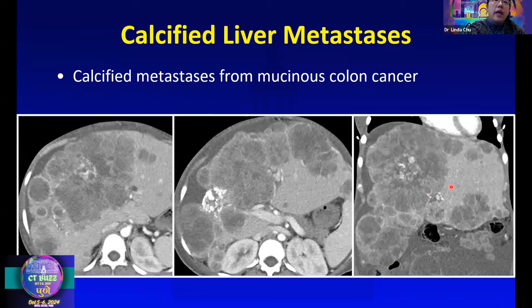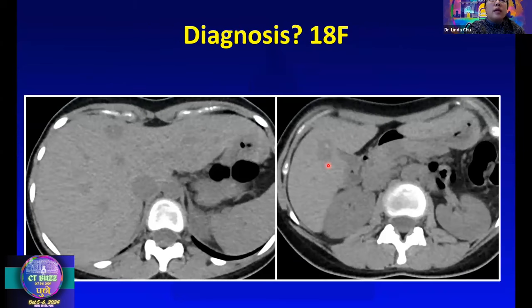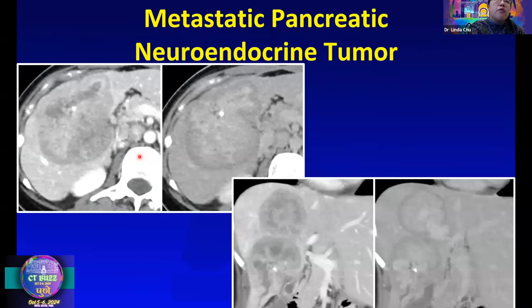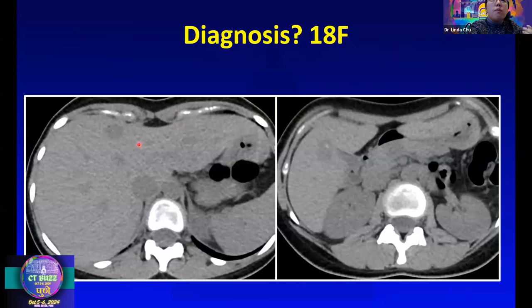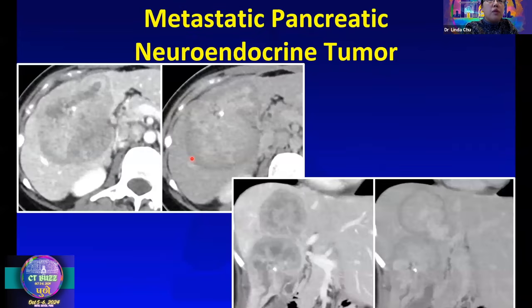Metastases can calcify — this case of mucinous colon cancer demonstrates that calcified metastases typically arise from mucinous primaries, either colon or GYN. Sometimes these cases are very difficult. This is a humbling outside case in a young woman with two hypodense liver lesions with faint calcifications — the enhancement pattern and margins couldn't be clearly defined, and nothing was done. A few years later, the lesions had grown substantially and turned out to be metastatic pancreatic neuroendocrine tumor. At 1.5 cm, you can't confirm benignity, so a liver protocol CT or MRI should have been performed for further characterization.